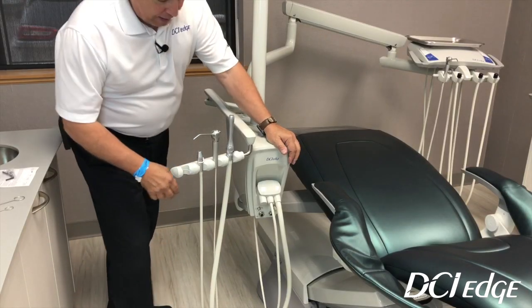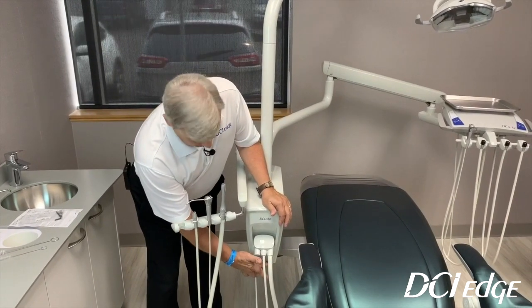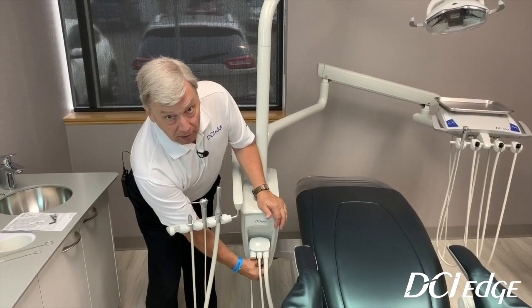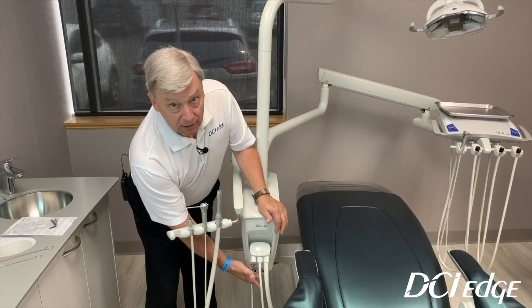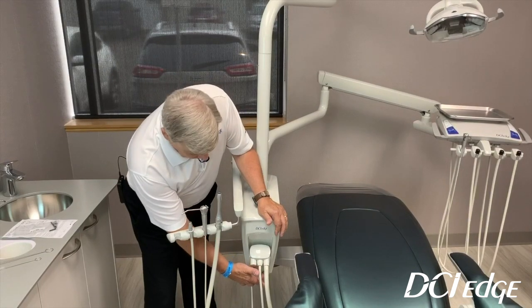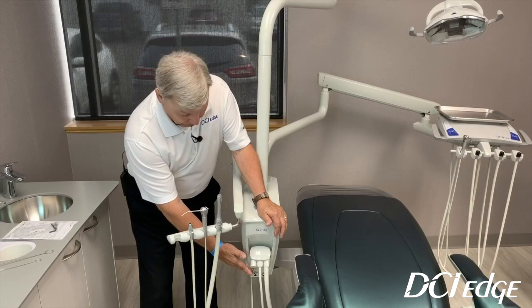Also, the standard on the post-mounted units is both an air and a water quick disconnect, and a water flow valve. The water flow valve will control the water flow to the water quick disconnect. So you can plug a Cavitron in — you can do both air and water — or plug a Prophy-Jet in. Those are standard on our Series 5 post-mounted unit.